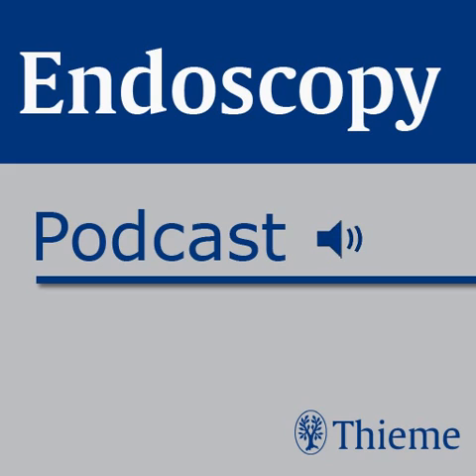The porcine model is a commonly used method for ESD training. However, ESD involves many maneuvers that are not commonly used in traditional endoscopy. As such, guidance is needed in order to learn the intricacies of the ESD technique. Supervision by ESD experts through a remote video-based system may be a practical method of achieving this guidance. The aim of the study was to assess the value of video-based remote evaluation in supervising ESD training.